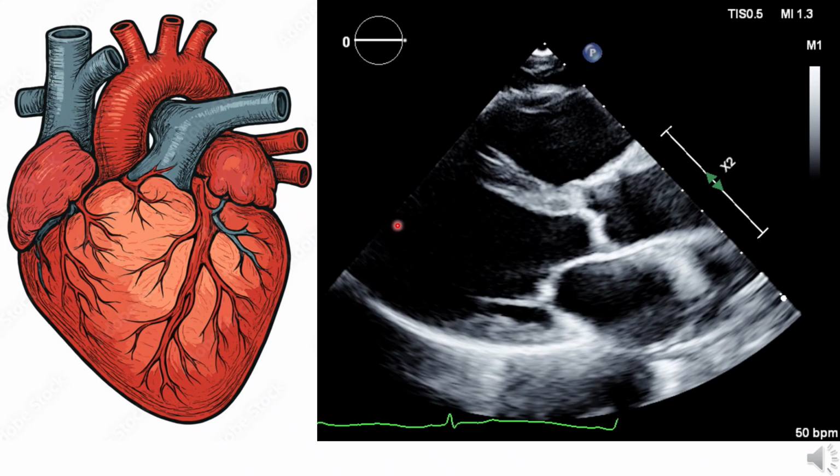The heart is imaged differently here, where the apex of the heart is towards the left side of the screen, and the aorta is going out towards the right side of the screen. The top here is actually the right ventricle. This is the left ventricle and the left atrium here.